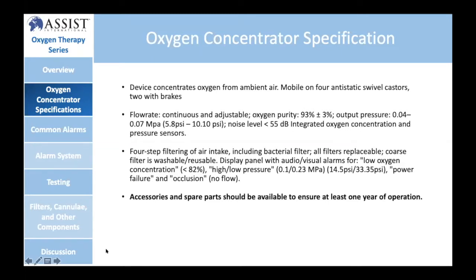Okay. And also we have to make sure that the oxygen concentrator comes with 4-step filtering, starting from the coarse filter, which is on the outside, up to the bacteria filter. That's also very important to mention, and this is according to WHO, by the way. And also it should come with audio and visual alarms for, as I said, low oxygen concentration, because we are talking about zeolite material that can be depleted after working some 15 or 20,000 hours, which means after that time the oxygen concentration goes down. So we should be able to get some feedback, to know about it.